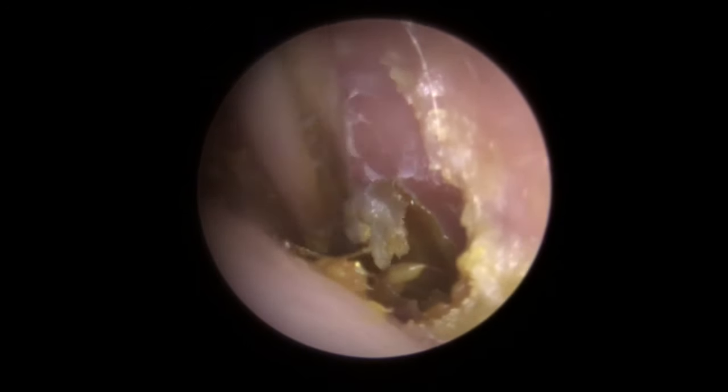Watch the ear canal entrance as we pull this out — you'll see we've got that main chunk there, but look, we're still pulling out from behind. It's still working its way out — it's just broken away there. So this is actually one of those skin ribbons. It's a long, long piece with a bit of wax built into it as well. Getting all this away — there we are. And we can see the eardrum now, which is great. So patient hearing a lot better. And we'll just do a bit of tidying up around the front end of the canal there.